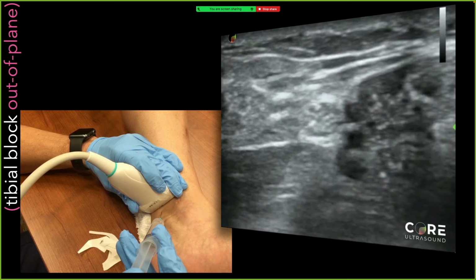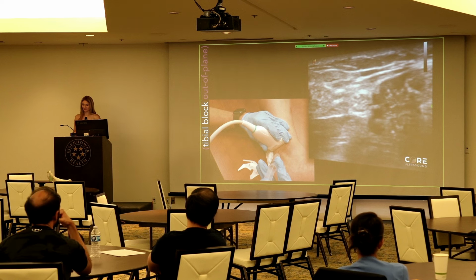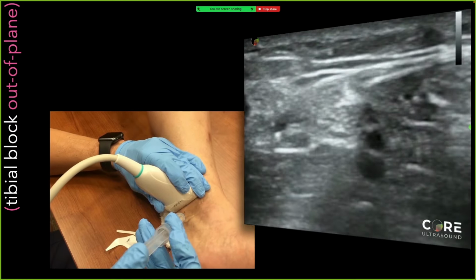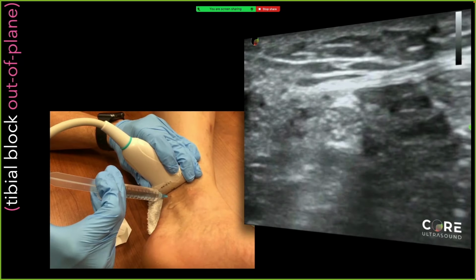And this is an example of a live block. It was actually kind of interesting to drive without being able to feel the bottom of my foot. It's a fun experience. It's fine. I could feel the top of my foot, so I had proprioception, but it was just weird. And so this is basically how your approach should be.